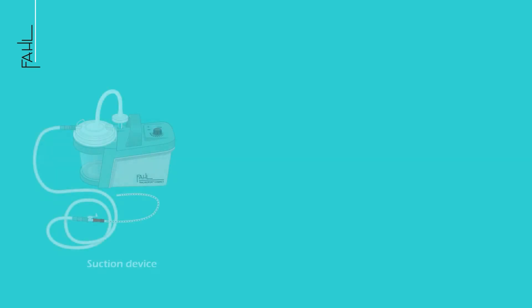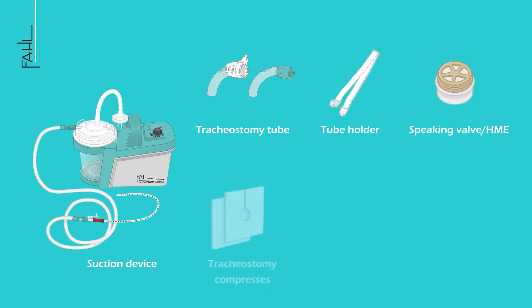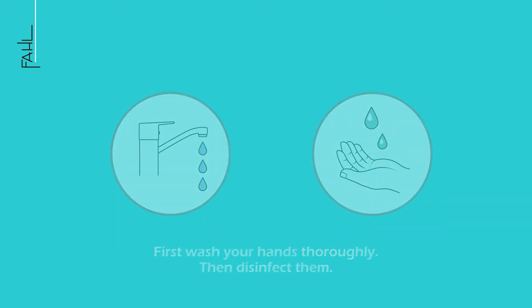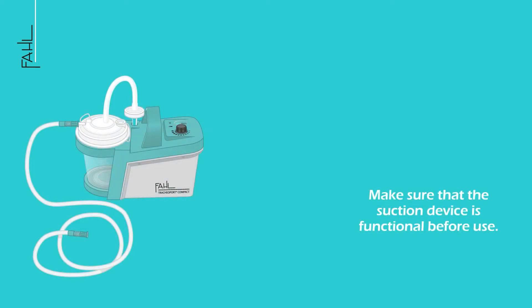To change a tracheostomy tube, you will need the following: a suction device, a clean tracheostomy tube, a tube support band, speaking valve or HME if applicable, tracheostomy compresses, cleaning wipes, and lubricant for the tracheostomy tube. First, wash your hands thoroughly, then disinfect them. Make sure that the suction device is functional before use.